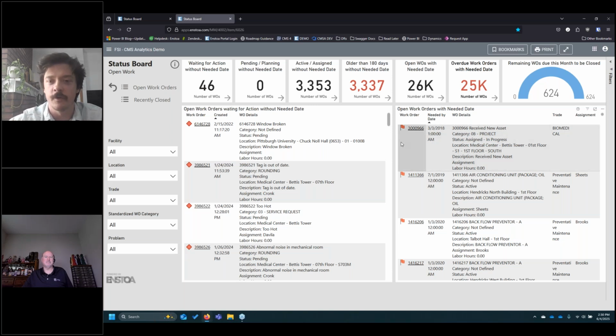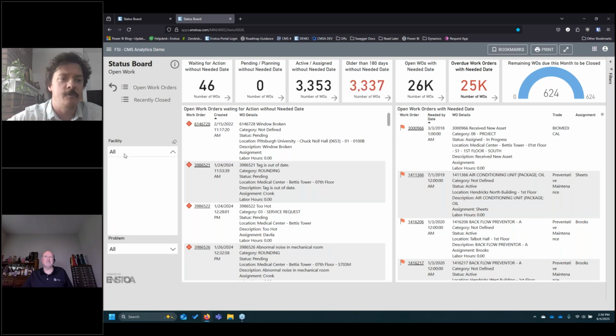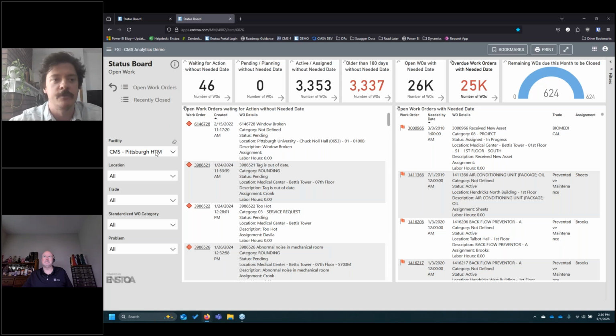These are your oldest work orders. This is how many work orders you have that are overdue on particular assets. If you want to break that down, maybe we only want to see the HTM data, then we can break this down to what's called a segment in CMS and view this only from the perspective of those HTM segments. And we can see that there's 19 work orders that have been generated that aren't yet assigned to anyone. They're in a waiting dispatch queue. 35 are being worked on.